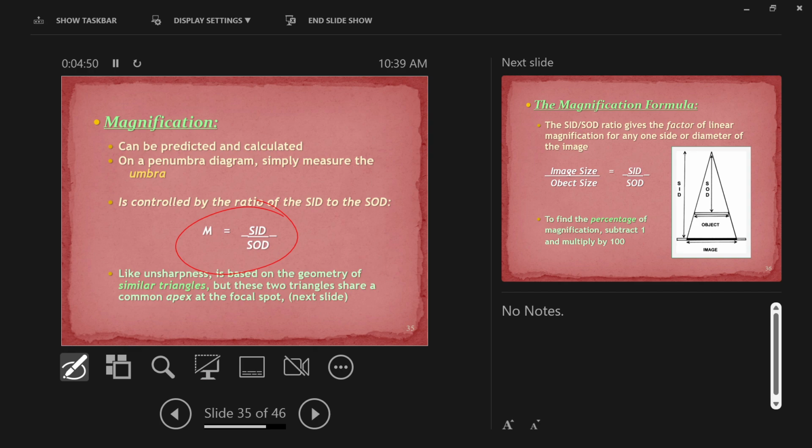You guys following where I'm getting the 4% from? This part of it. So this is saying the object is as big as it is in real life, plus 4%. Okay? Let's do the other one. Let's do the larger hand, and then I will give you the numbers here. So we're going to do this one now.